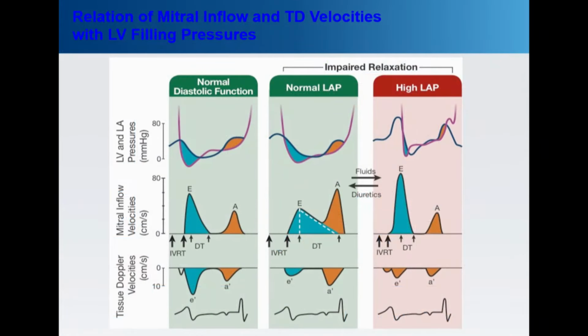The actual Doppler methodology is based on looking at filling and motion, and then using filling and motion to draw inferences about diastolic function. So we're going a step backward, so to speak, not a direct look at what is happening. During early diastole, there is a left atrial pressure that exceeds the left ventricular pressure, opening the mitral valve, with forward flow in early diastole and filling of the ventricle. We can look at how fast the ventricle fills here. Still, we are looking at filling, really, not looking at pressure.